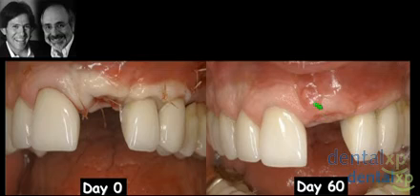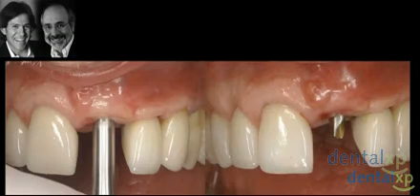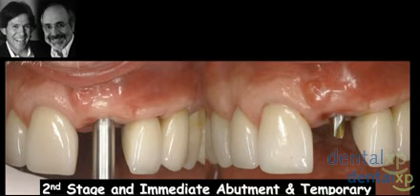We can treat this as a single central, and I was a bit concerned about the second stage uncovering. So what we decided to do, rather than take the risk of a reentry procedure, is a simple tissue punch recovery of that implant, making sure that we leave the thickness of tissue that we were able to recreate on the facial of the lateral and the mesial, and then place the abutment that was created from David's impression at the time of surgery directly onto the implant through that tissue punch exposure. And this really allows us to immediately place the abutment, gives us access to the area, and allows us to start shaping the tissue with the temporary restoration.